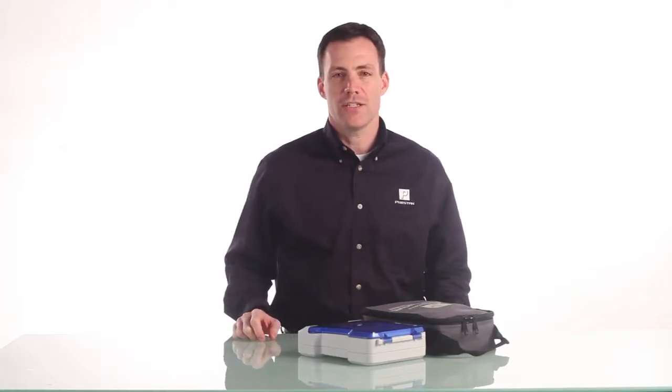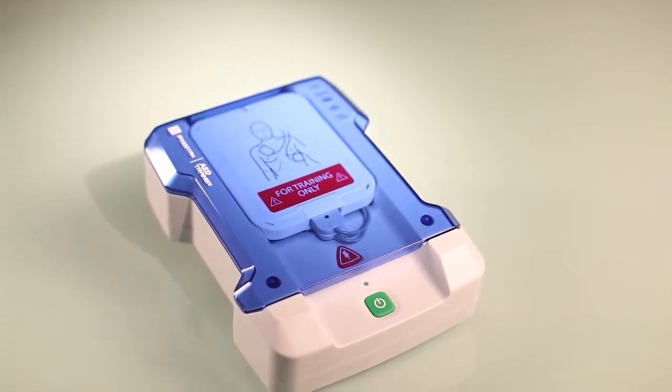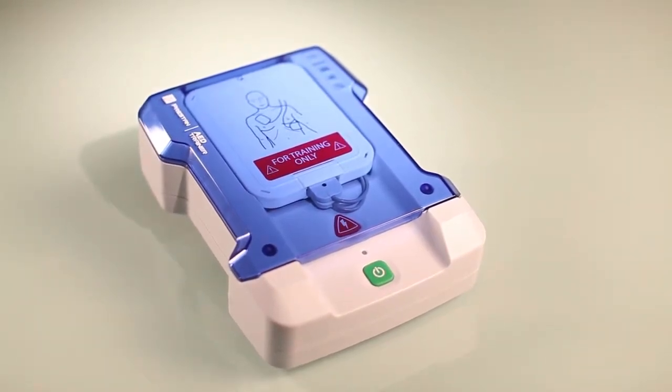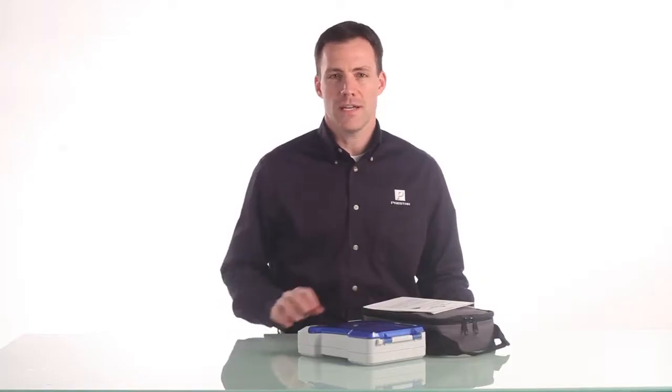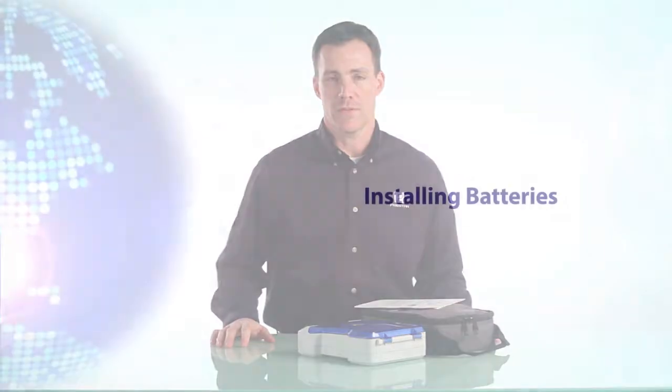The Prestan Professional AED Trainer is an innovative and exciting new product for the CPR AED instructor. The purpose of this video is to help you set up the units and explain some of the features of the product. Everything we're going over here is contained in the instruction sheet, so if you have trouble with something you can always refer back to the instruction sheet or the video.